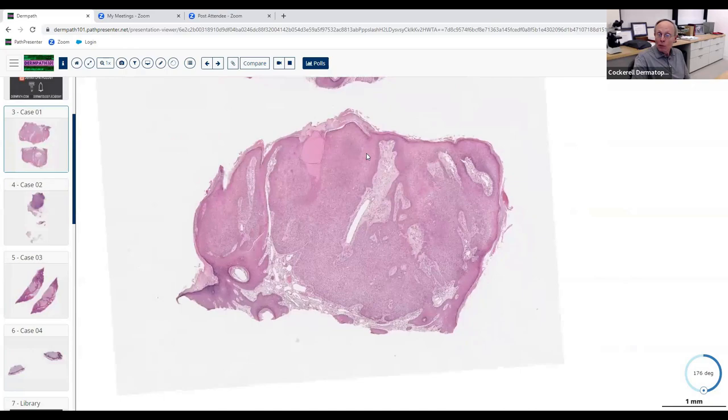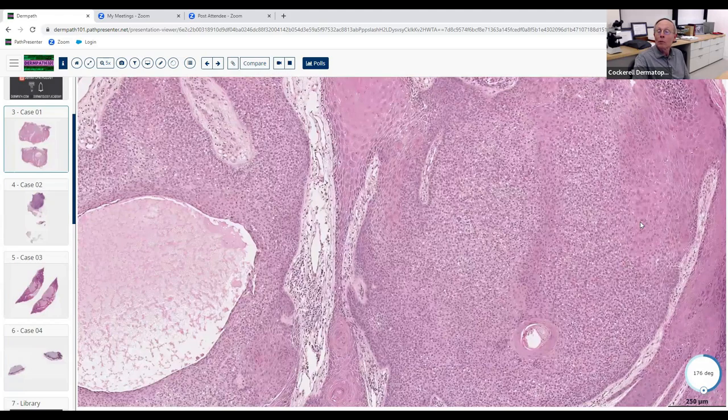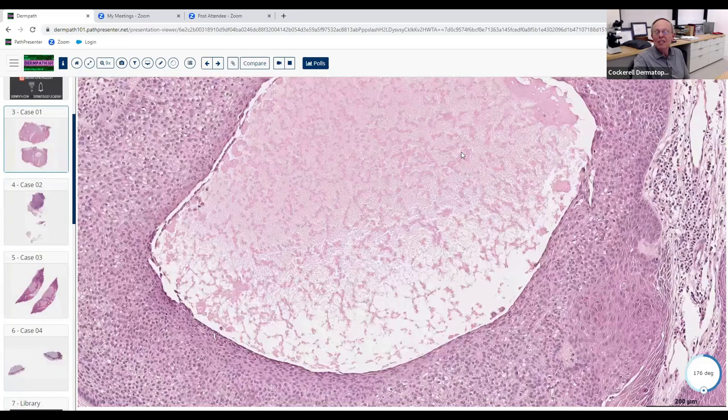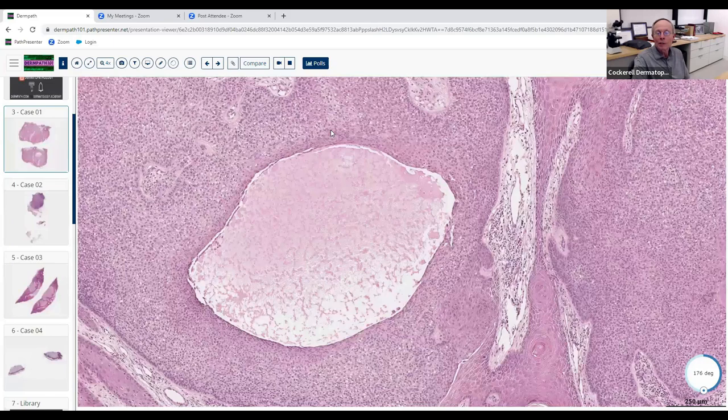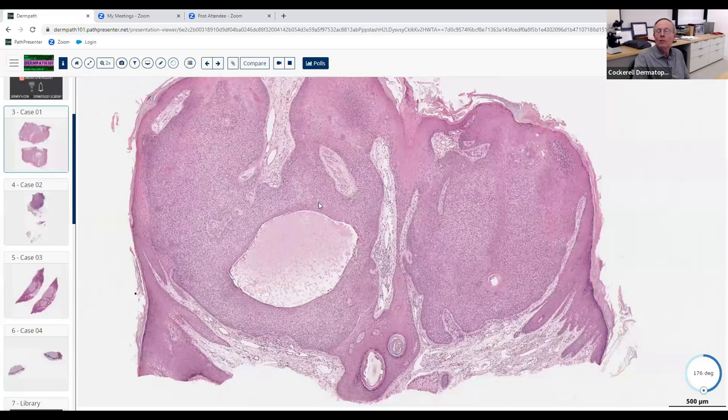Trichilemmoma is fine — that's actually what this is: a tricholemmal trichilemmoma or tricholemmal verruca. This area over here is probably just a zone of cystic degeneration in the lesion. I don't think this really represents apocrine differentiation — I think it's just an area that crusted a bit with some pseudo-cystic morphology. Is there any clinical significance to this lesion?